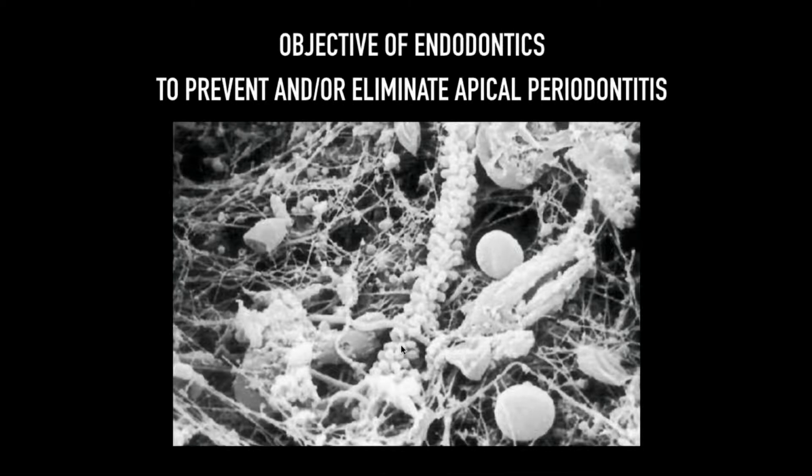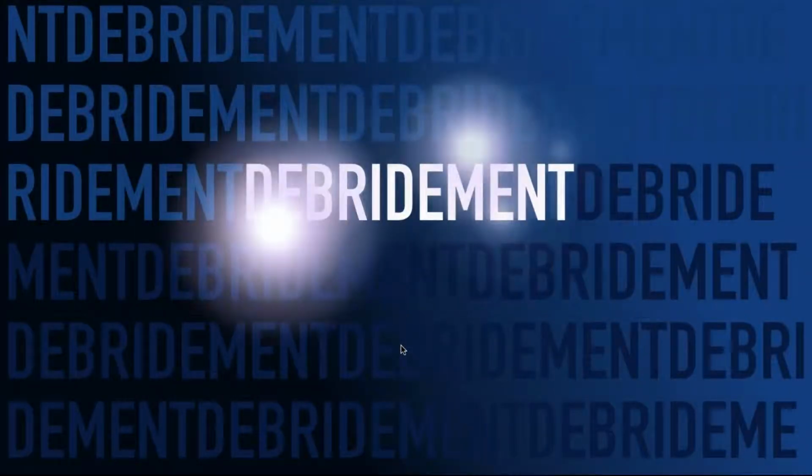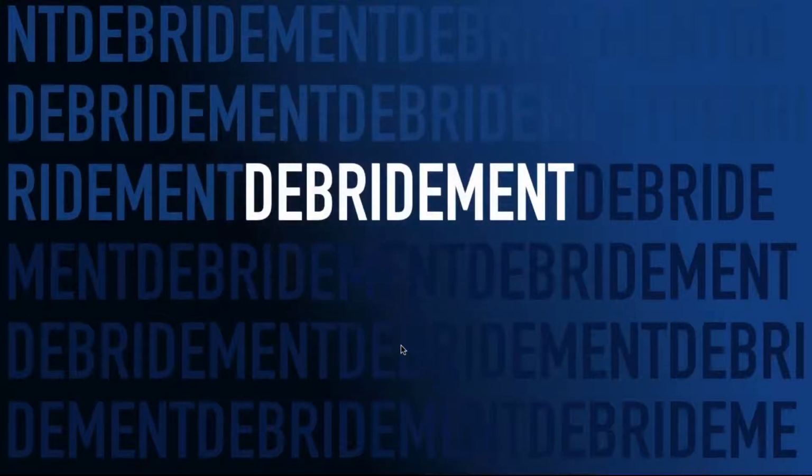And that, of course, is the objective of endodontics, and the objective of dentistry is good oral health: eliminate pathology, prevent pathology, and of course, retain the natural dentition wherever we possibly can. Now, the most important part of root canal treatment is debridement and disinfection, removal of the organic substrate, hence the dental pulp, as well as removing any bacteria that remain in the root canal system. And everything we do up until our final irrigation protocol is in preparation for that final irrigation protocol.